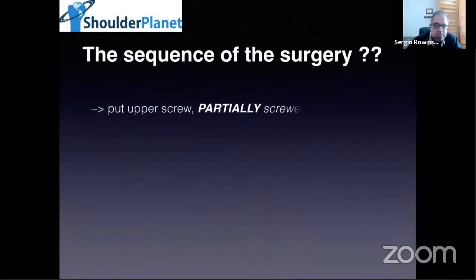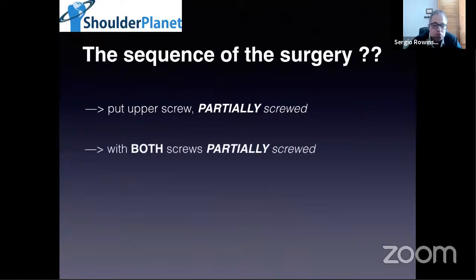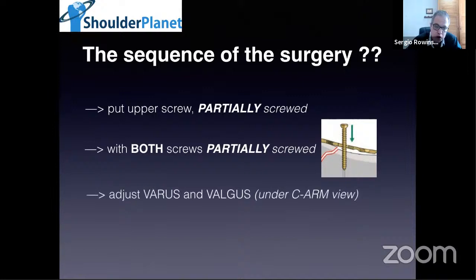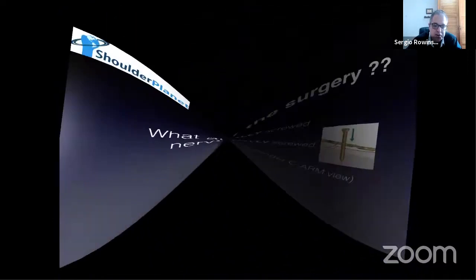After that, I put an upper screw until the second cortex, and I come back and keep it in the proximal. So both screws are partially screwed in only the proximal, the anterior cortex. This is the moment in which I have length, and I'm going to adjust varus and valgus under C-arm control, and fix the plate with the two screws, and then it's a matter of putting the most distal screws in the proximal and distal parts of the plate.